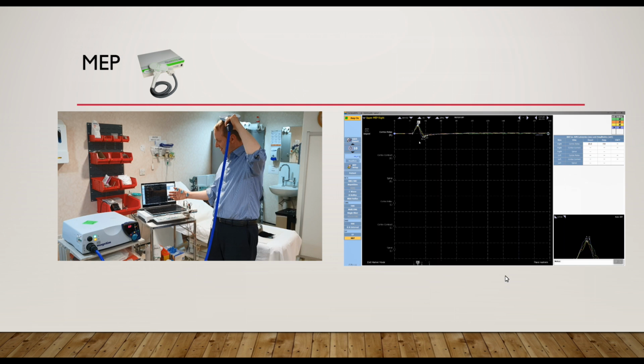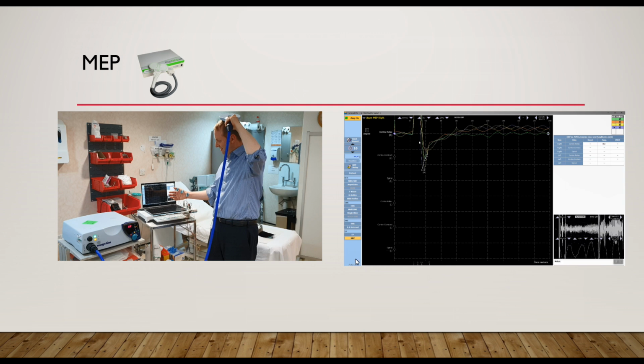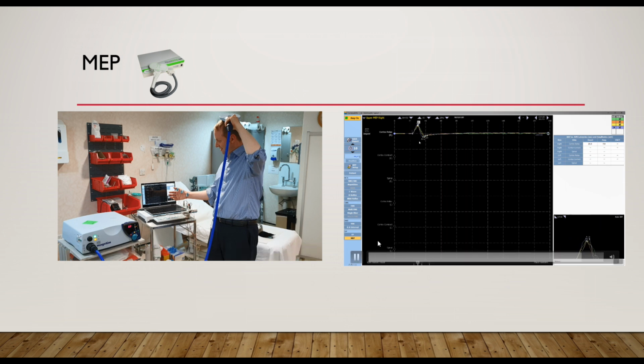And what happens over here is you can see these are the motor responses being recorded, and then basically what you will then do is mark up these responses, and then you can work out exactly the cortical latency, and you can also stimulate it over the brachial plexus, for example, or over the neck, and make a variety of calculations to work out what proximal conduction is looking like.